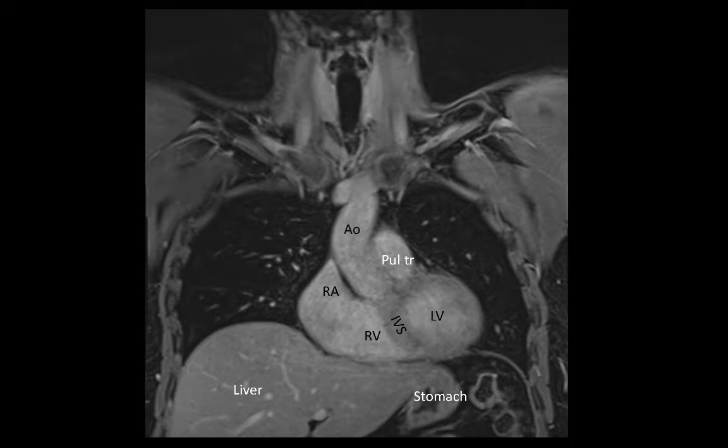We can see the left brachiocephalic vein crossing the aorta, and more superiorly we can see the lumen of the trachea.